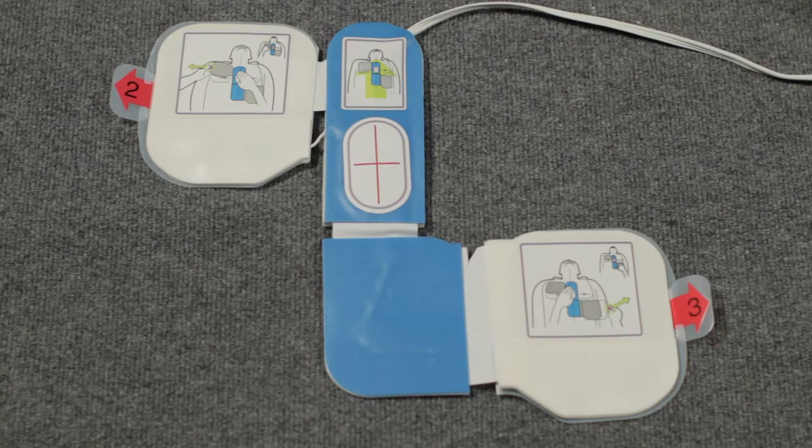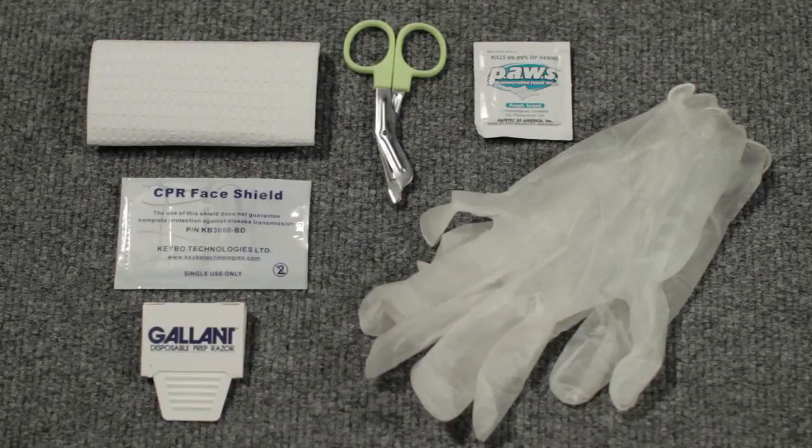It has a one-piece electrode pad for analyzing the heart and delivering a shock, and a CPR landmark that allows the AED Plus to see your chest compressions and encourage you to perform CPR at the correct rate and depth.